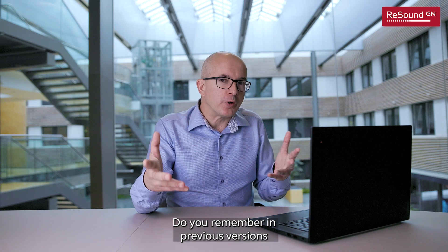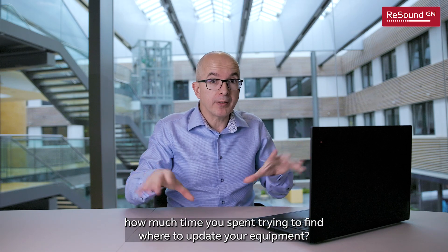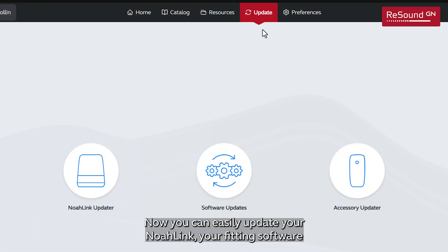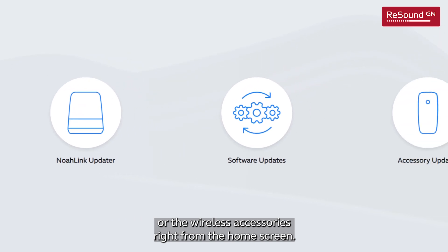Do you remember in previous versions how much time you spent trying to find where to update your equipment? Well, that's gone. Now you can easily update your NoahLink, your fitting software, or the wireless accessories right from the home screen.